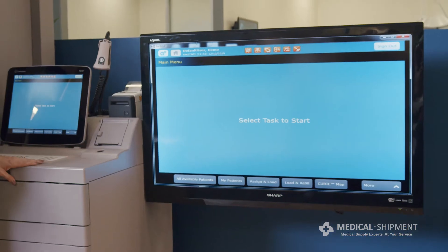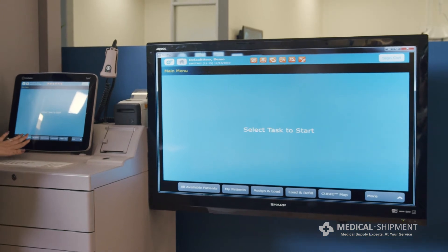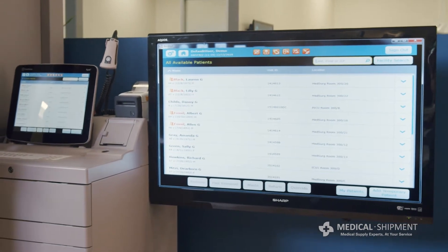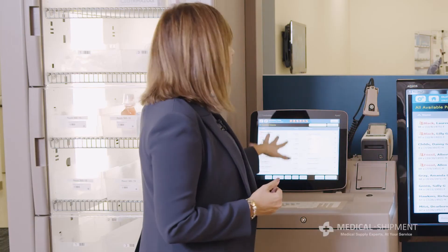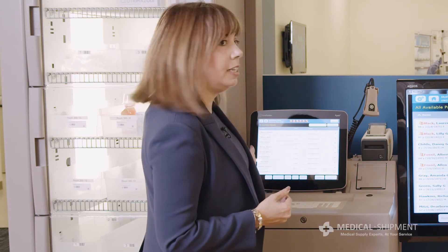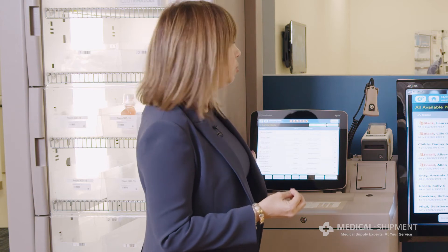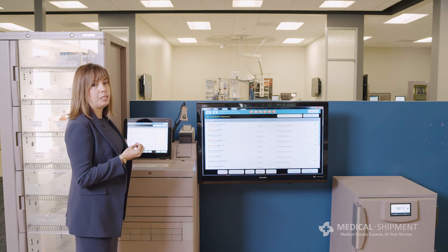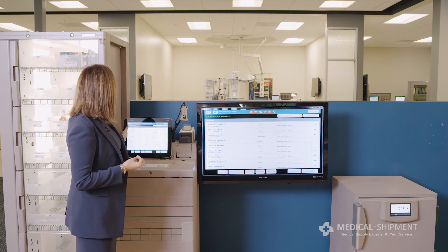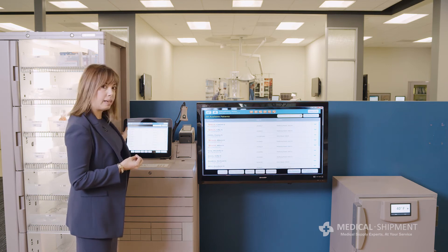Looking at the screen, I'm going to touch on all available patients. This brings me to the patients available to me on my assigned unit that I can now review. If you see here, there are some names highlighted in orange. This alerts me — and this is a nice safety feature of Pixis — that there are patients with the same name. It's a name alert that requires me as a nurse to be diligent in selecting any patients that have orange, like Lily and Lauren Black, for example.